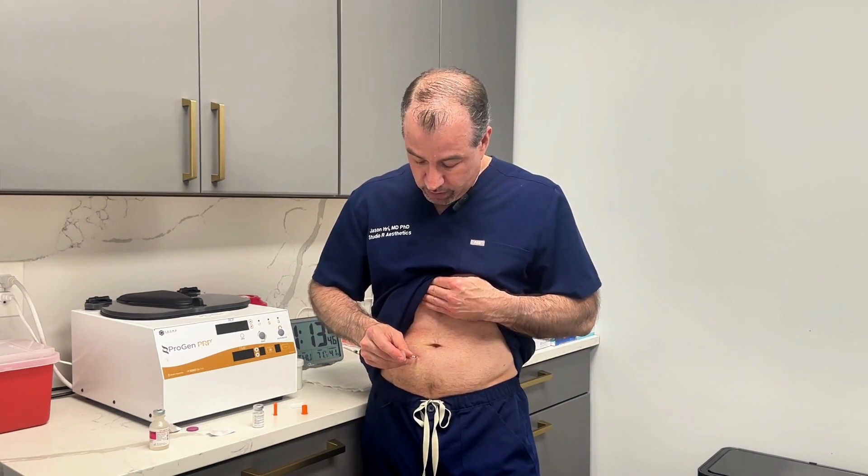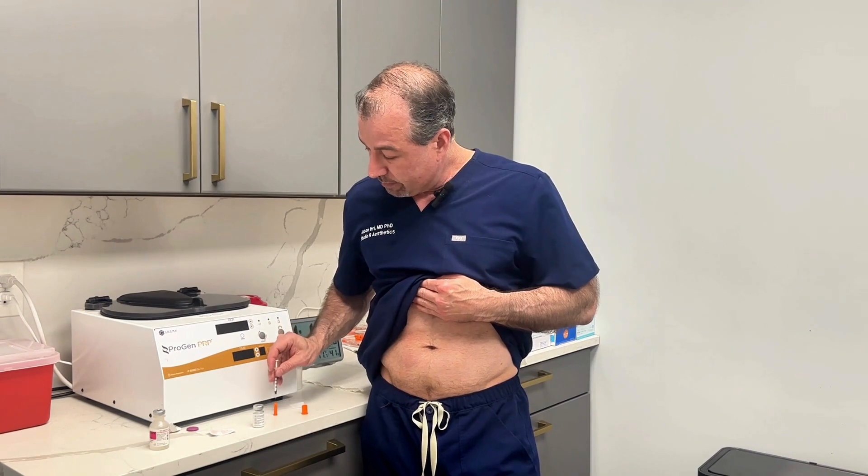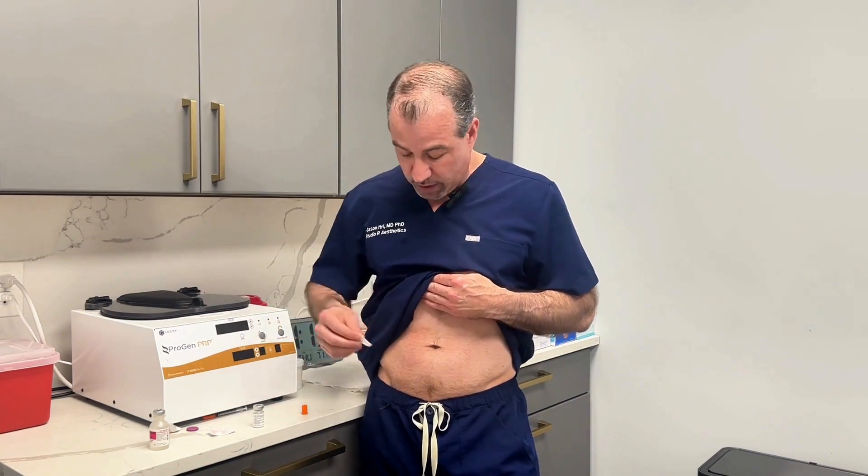Inject the medication and then recap it. What I do is put the alcohol on there for a couple of seconds afterwards, just because every once in a while you get a little drop of blood and you don't want to get that on your shirt.